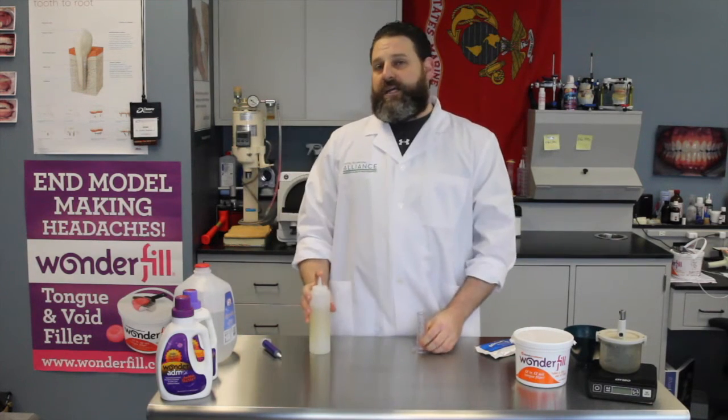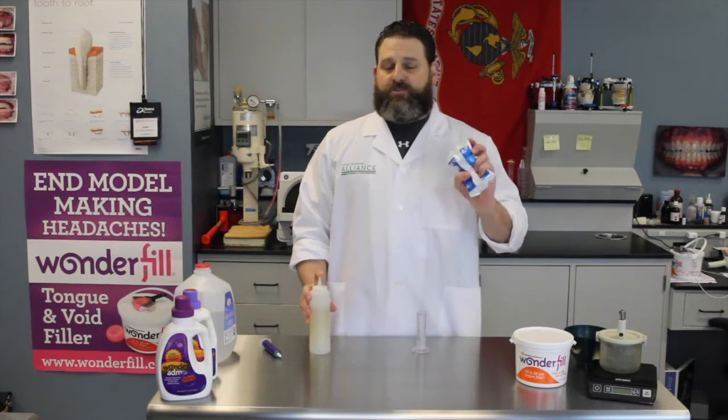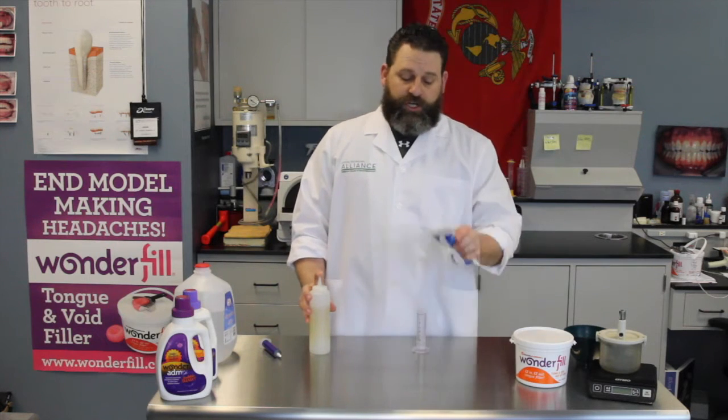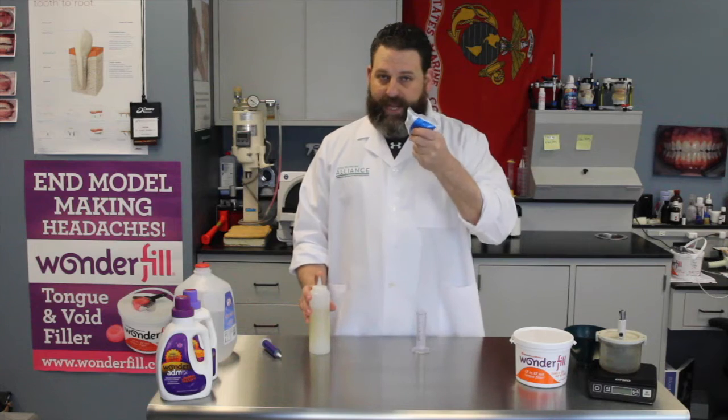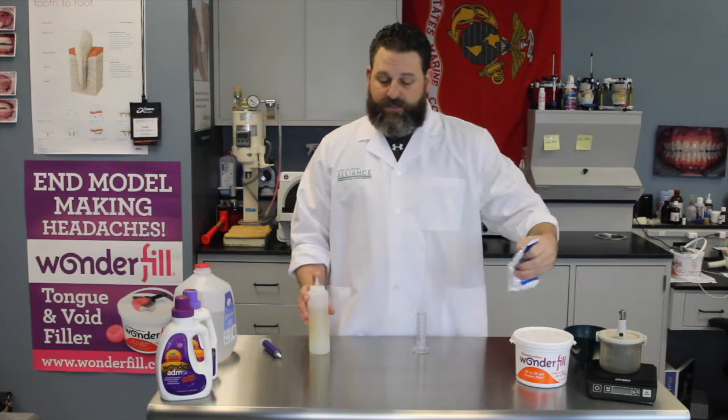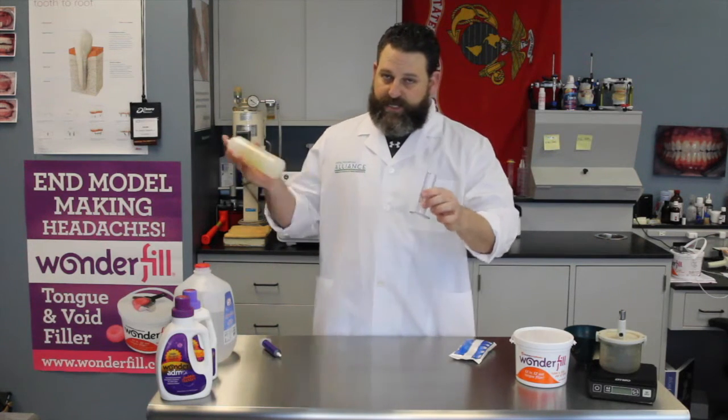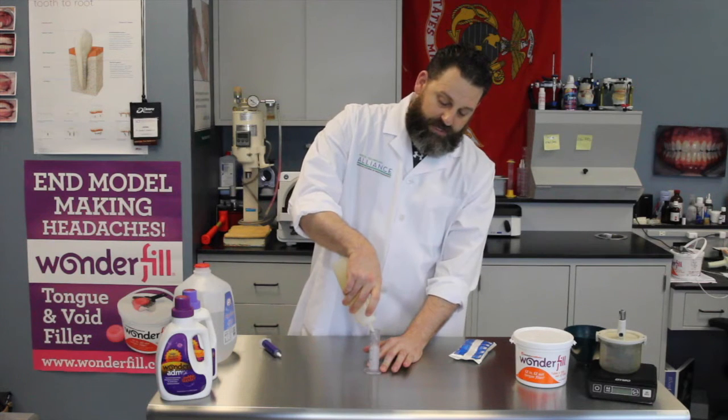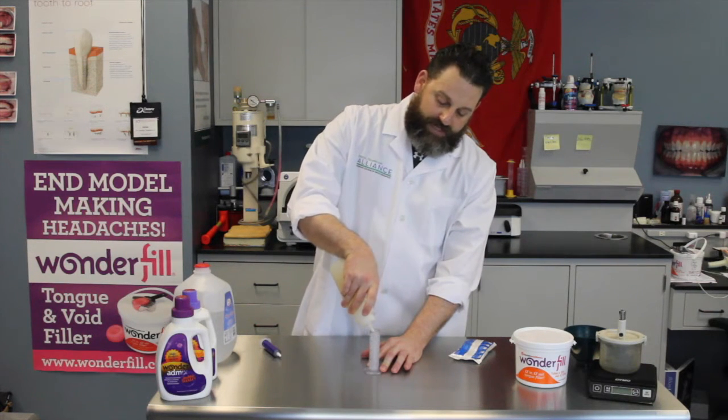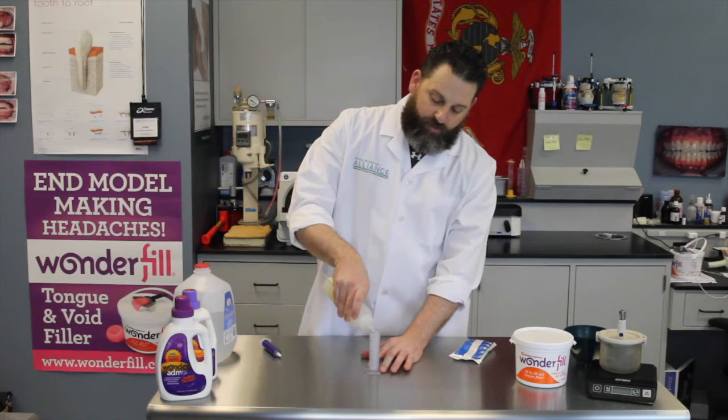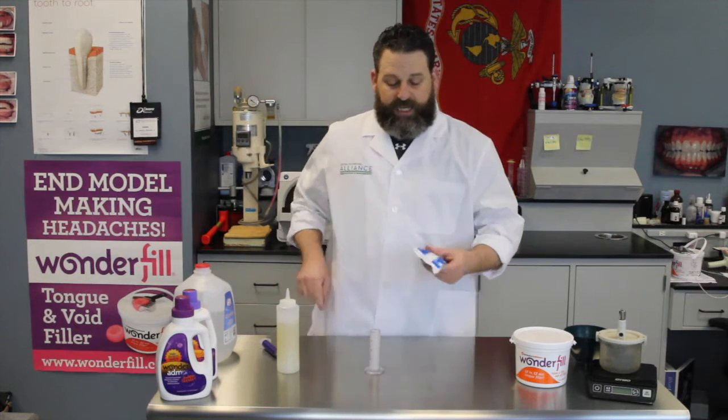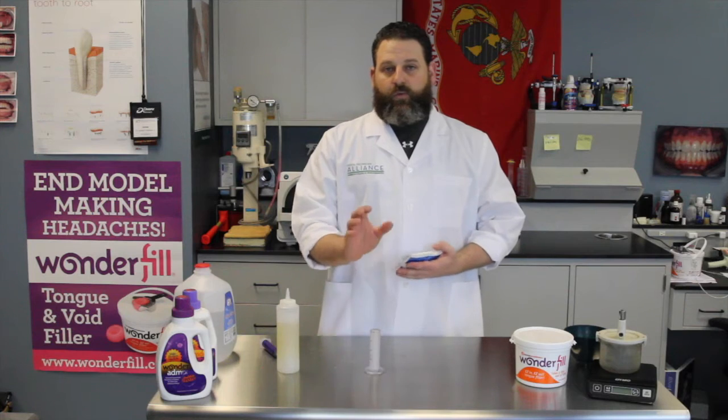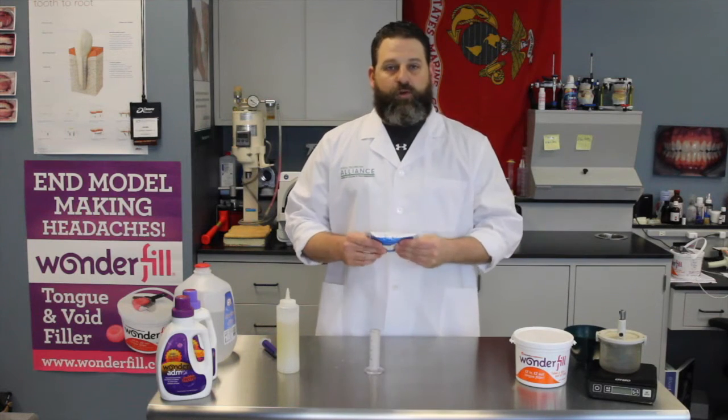So every time you're going to use the Micro Stone, whatever stone that you're going to use, you're going to know the weight, either get the pre-weight packages or weigh it out and then use your graduated cylinder to fill up your admix. This is all I'm going to do for my model that we're going to be making. Fill it up to the 41. And now we have the proper water powder ratio for the model.